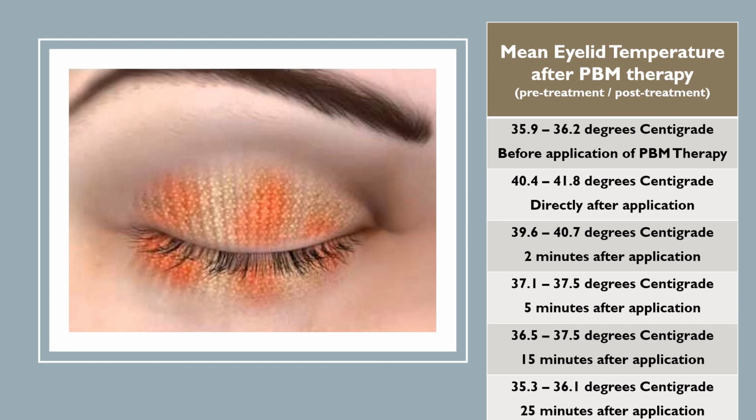I don't even try anymore. So we do it in the room with the MeibaFlow technology almost always. I'd say 85-90% of the time, that's how we do it. When somebody's just out of control, I'll still go do it myself and grab some forceps and express them.